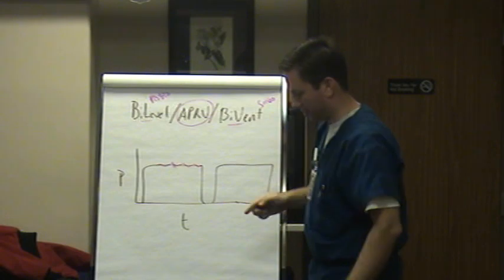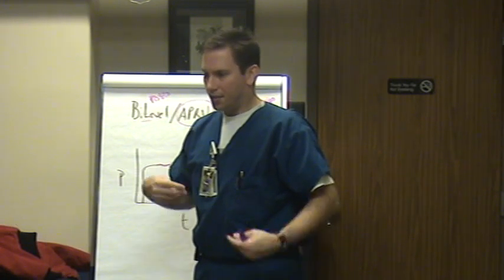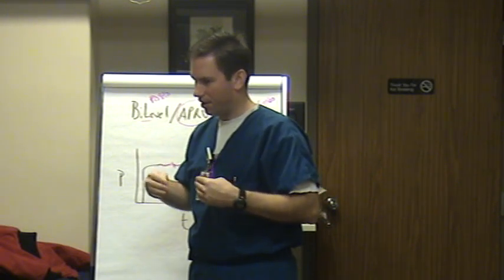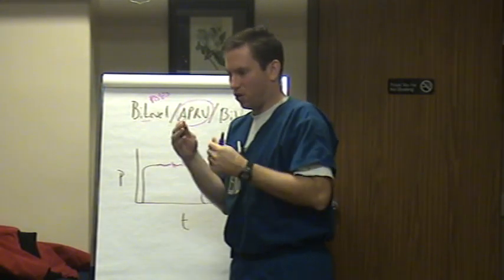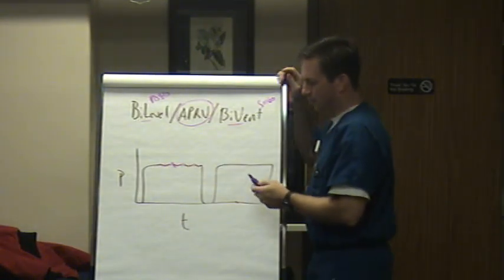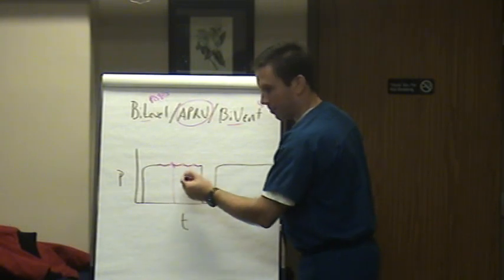I'm going to try to do an impression in case that camera's on me right now. Here's what it looks like. The vent inflates the lung, and the patient goes, and then they exhale. They can breathe in and out during any part of the respiratory cycle. Does that make sense? I'm still pressurized, and now I'm just breathing in and out. That valve is floating. It's no longer locking me out. So the patient can breathe in and out at this point, at any point they want. So no longer will the vent alarm and cycle off. So look, we don't lose all that mean.